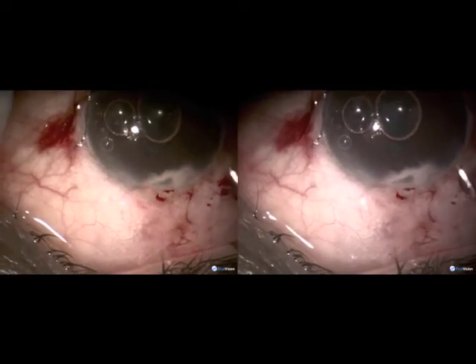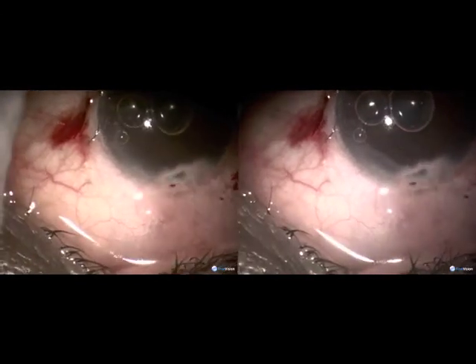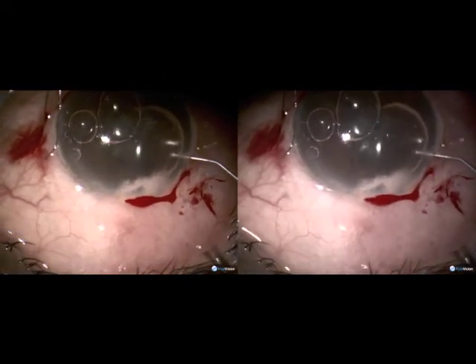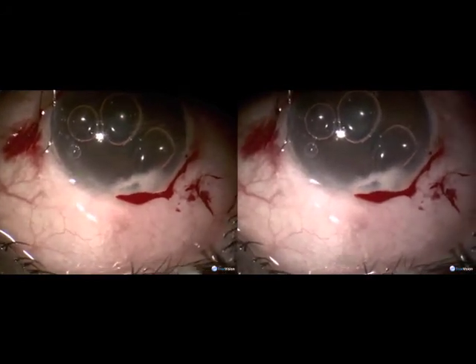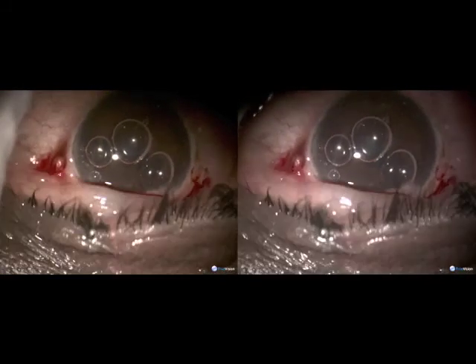Just clear with the cannula. Some more air is injected — some of it passes out at the tract, confirming patency. And that is the end of the procedure.